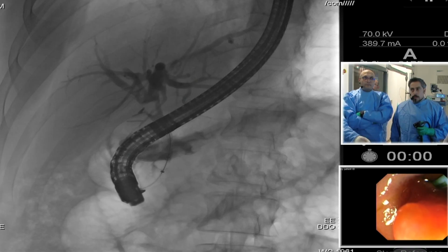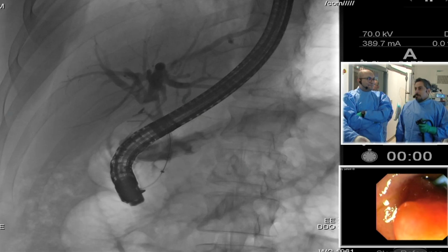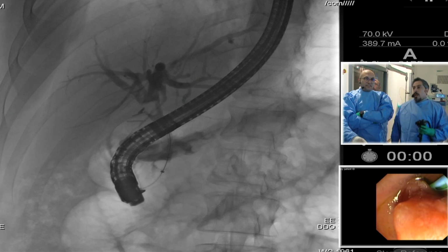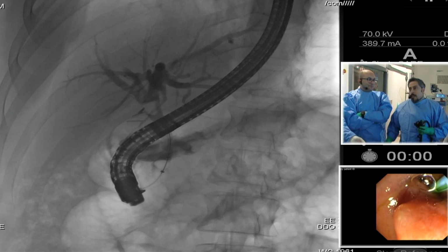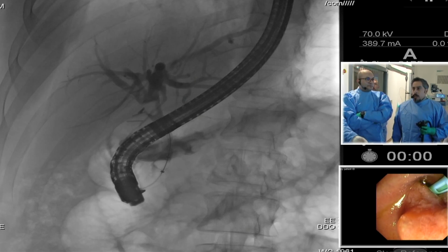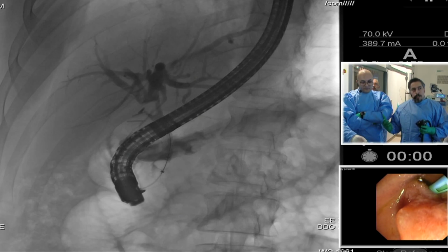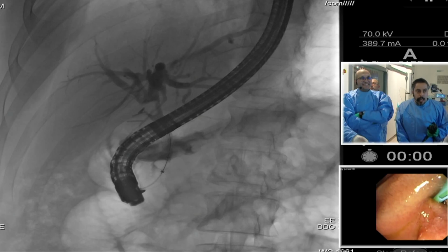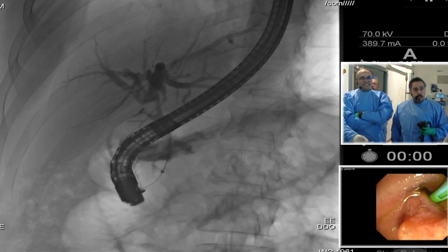I'm not sure about the tapered end at the end. If you do balloon plasty at the sphincter, and then you hold the stone and crush it, that is mechanical lithotripsy, without laser. Yes, you are absolutely right. I always give a trial for mechanical lithotripsy before cholangioscope, just considering the cost. However, we did ask for a mechanical lithotripsy basket, but unfortunately it's not available.